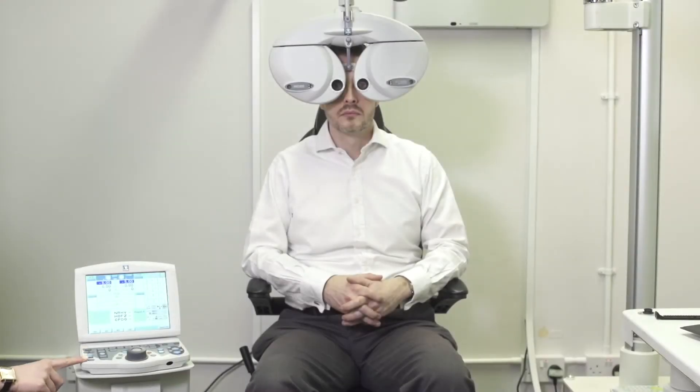Using the touchscreen or the buttons on the control panel, the optometrist is easily able to run through their subjective refraction routine. They can choose to do a monocular refraction using the occluders just here or a binocular refraction if they wish.